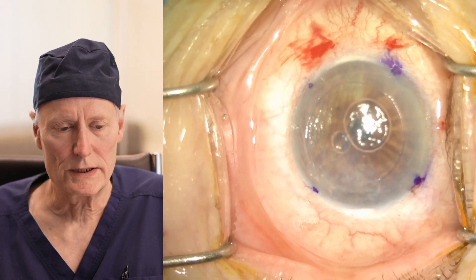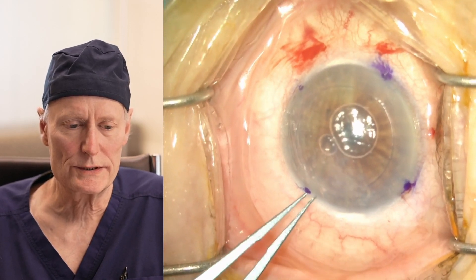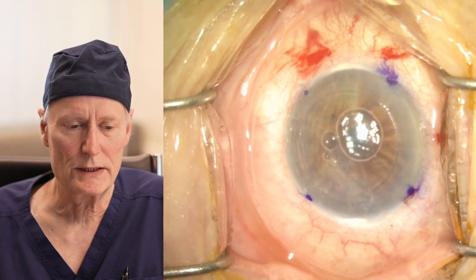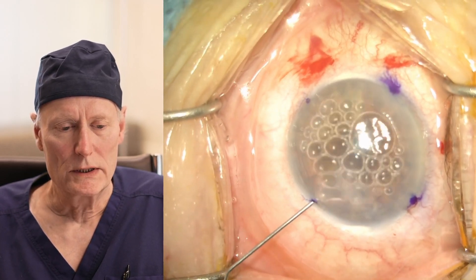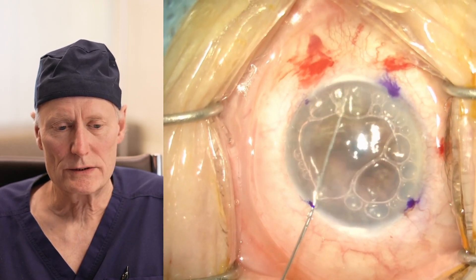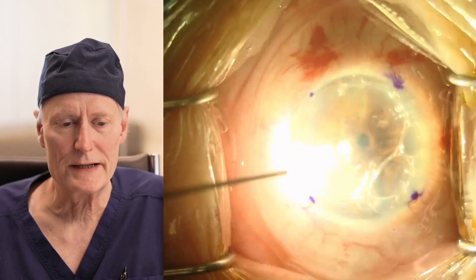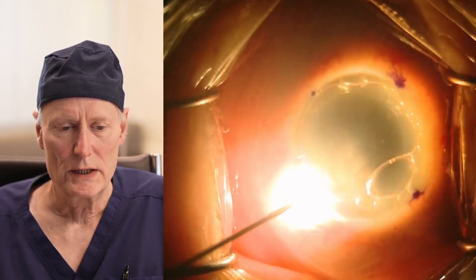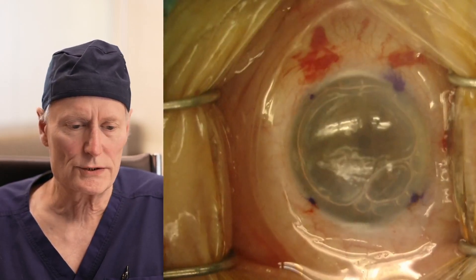This is really the longest part of the surgery, though the surgery is generally very quick — five to ten minutes. This is a refill of the front part of the eye with air so we can check to see if we've left any cells behind. We have a little light that we can shine from different directions to look for any cells, and there are no cells left behind. We stripped off an entire sheet, so everything looks just perfect.